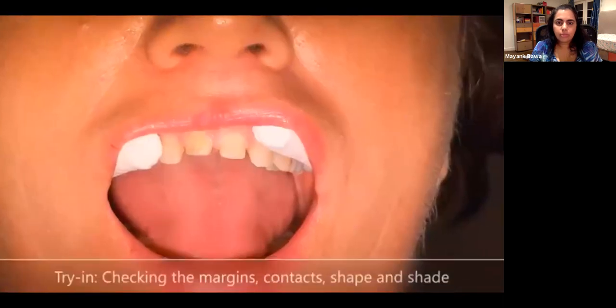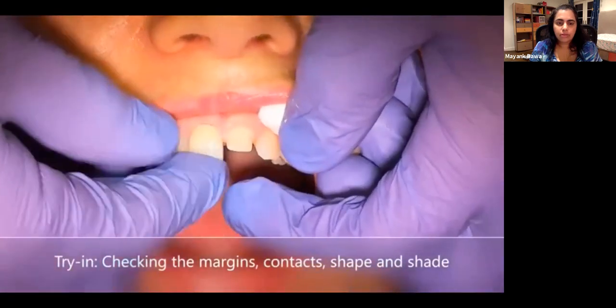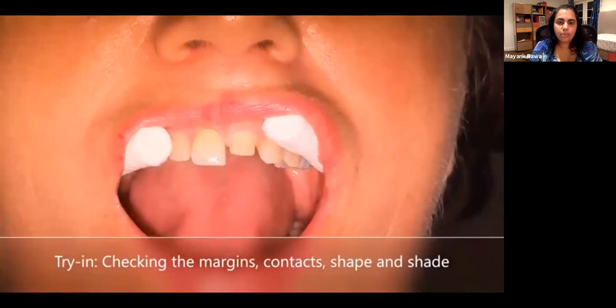Slow speed. This is the try-in. Go through the steps to check the contacts, margin, shape, and shade of the crown.